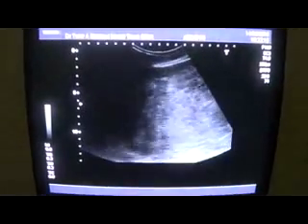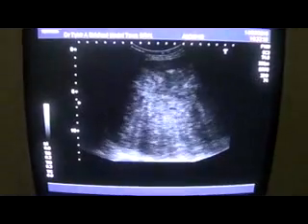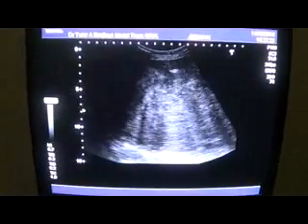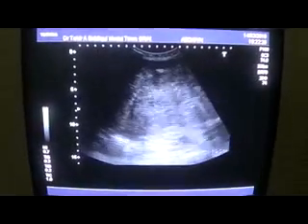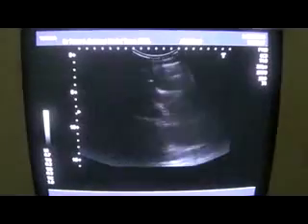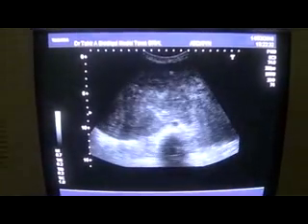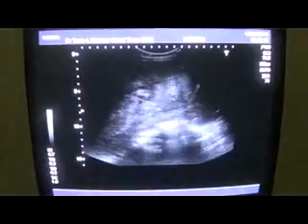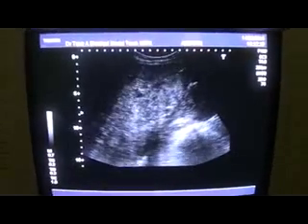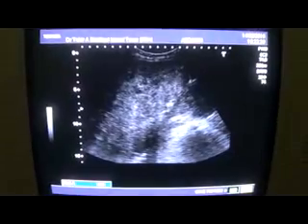What goes in favor of a fibroid, a large, huge fibroid occupying all of the abdominal cavity, is that we see calcification within it. We also see calcification at its lower border here. This is a calcification.